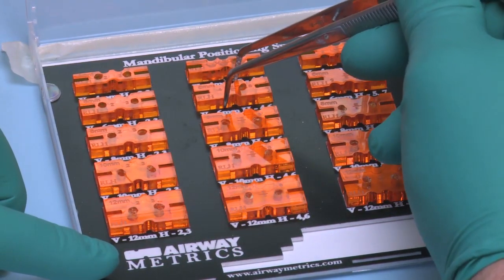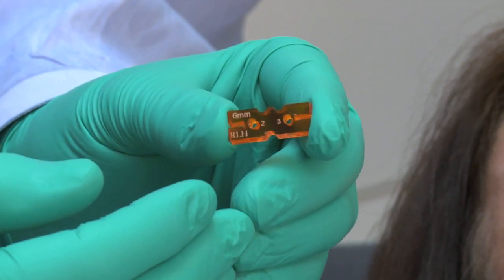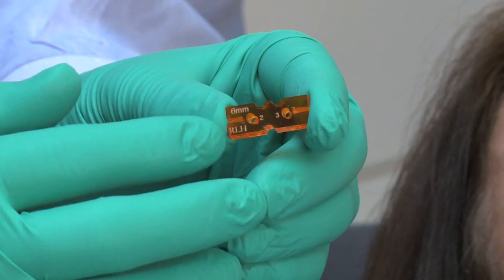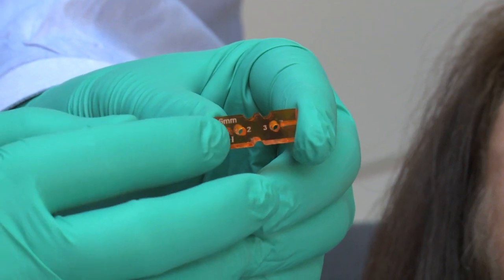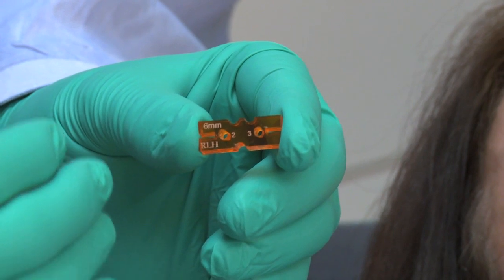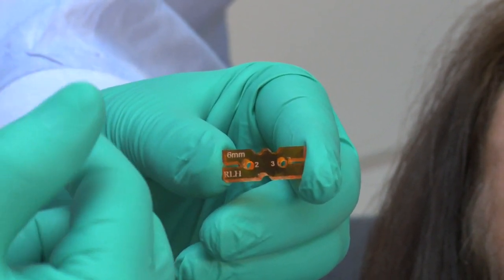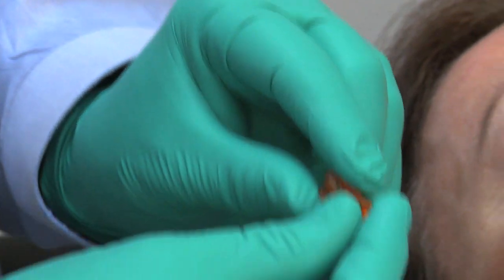So here is 6 millimeters vertical. When we start to add more horizontal to our bite registration or protrusive, you need to make sure that the amount of movement forward or horizontal protrusive, that number faces the patient's throat. So we're going to add 2 millimeters of horizontal movement. So their maxillary anterior teeth will go in this notch. The 2 is going to face her throat. Her mandibular anterior teeth will come into the notch on the lower.